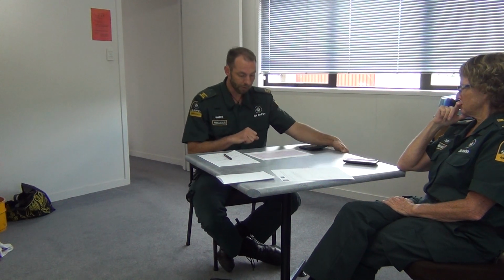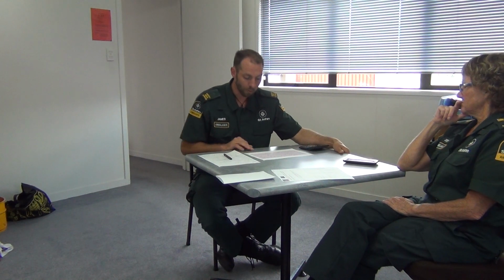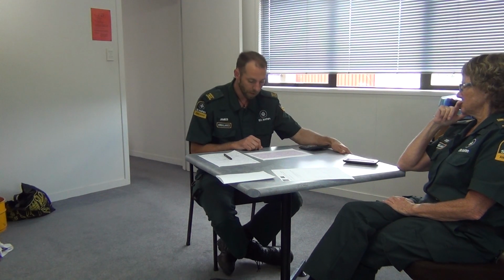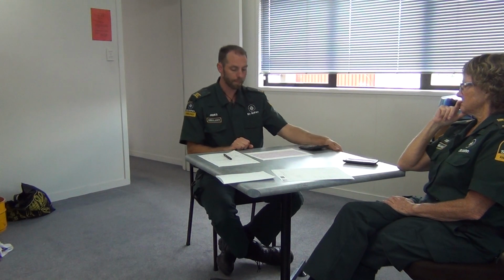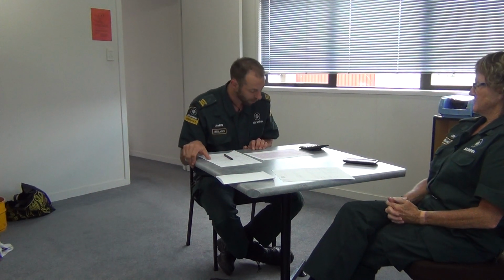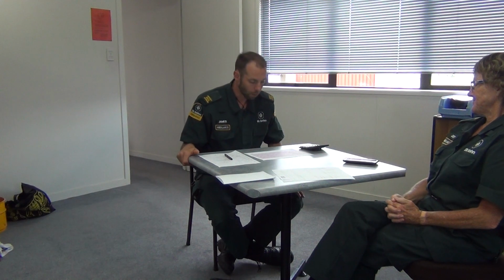So looking at this ECG, I'm going to say that this patient has Wolff-Parkinson-White because of the delta waves that are widespread and the shortened PR. Okay. So just to say that the T waves, there's none that are 2/3 of the R waves, so there's no ischemia there. All right.